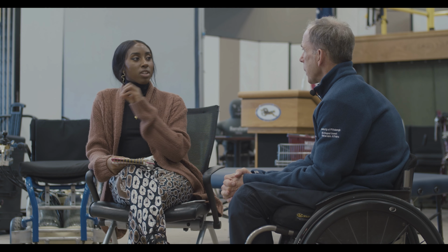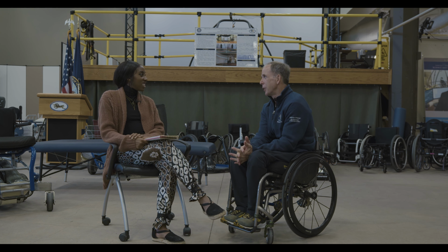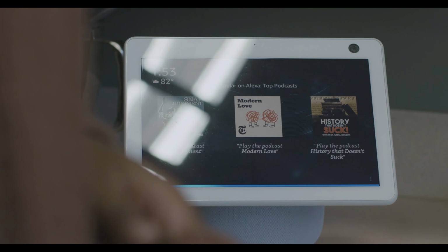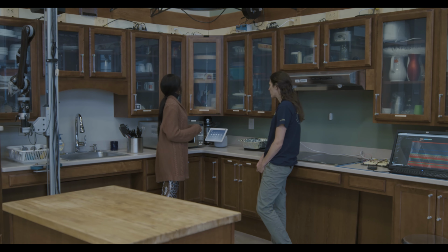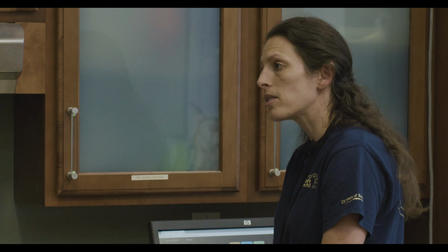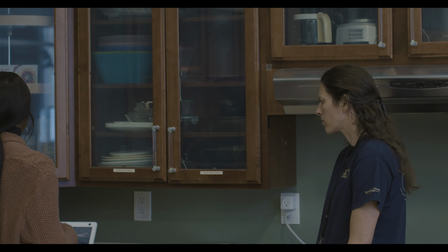You guys are really hitting every part of life in a sense, trying to create a holistic quality of life. Yeah, well, you've got to be able to get out of bed in the morning. You've got to get through your morning routine. You've got to be able to get to work or school, or just participate in the activities of daily living. We're doing some smart home technology, utilizing a kitchen space. So different users that have maybe some cognitive impairments, we've incorporated Alexa so we can have different commands in the kitchen. And the cabinets will light up and prompt the user to focus their attention there.